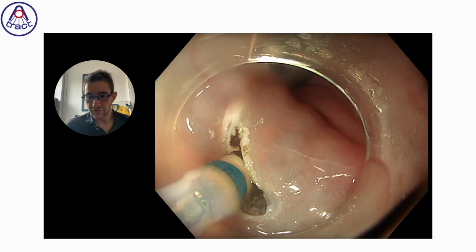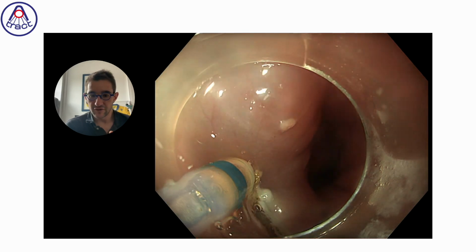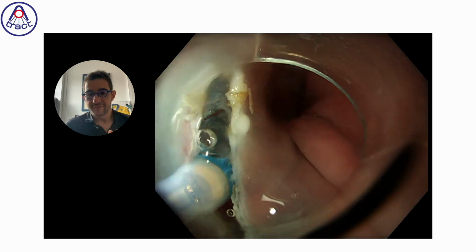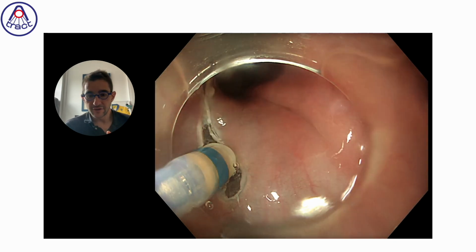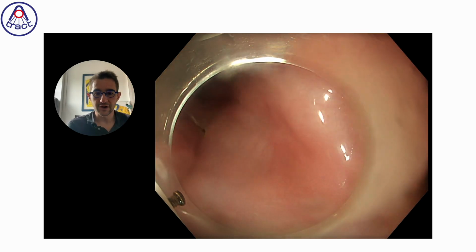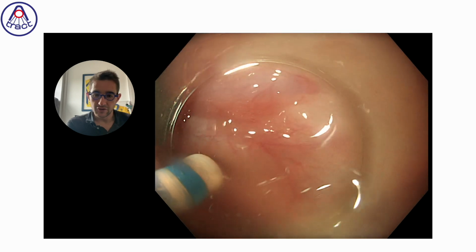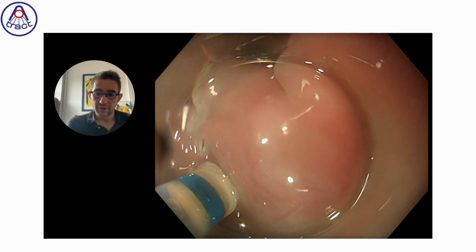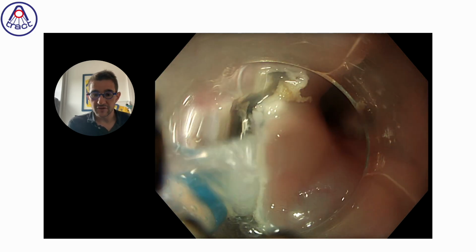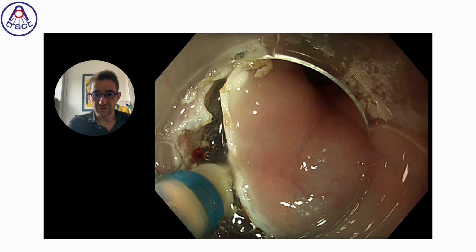So now we have to work on the distal edge of the tunnel in order to open the space and be able later to find the end of the tunnel. So here you see I work a little more in order to do a relatively large incision, because sometimes we can miss the exit of the tunnel because it is not large enough.